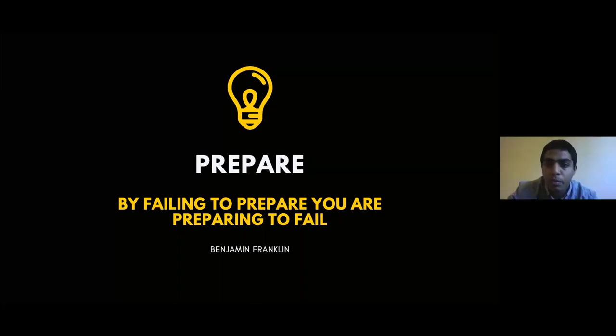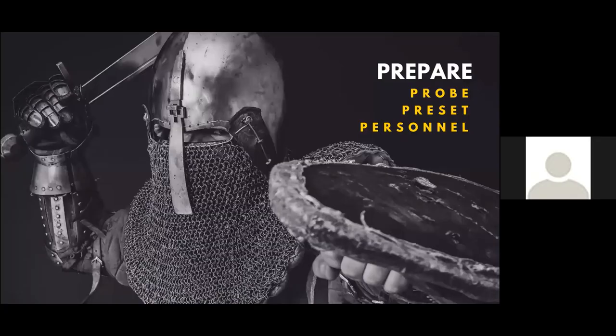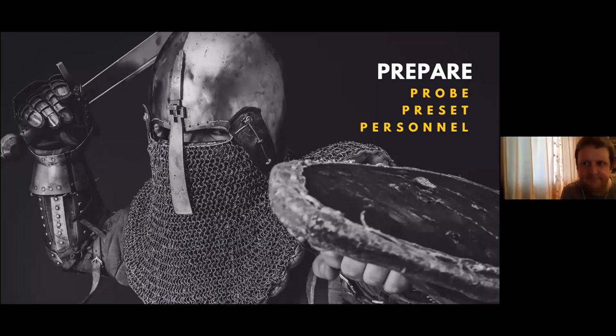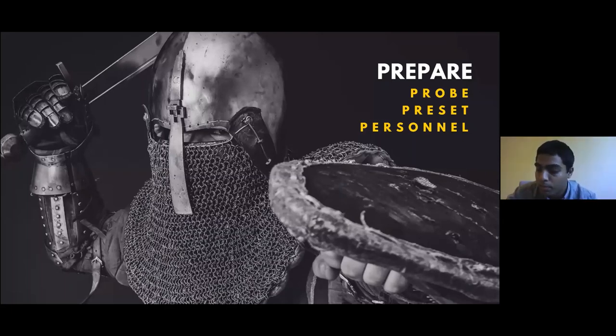The second important thing is to prepare before entering a patient encounter — have all equipment ready before you go in. I've put 'prepare' under three Ps: probe, preset, and personal. For the probe, you choose the correct probe, place jelly on it, and place a probe cover. Probe covers are stored below the machine. The curvilinear probe is most likely what we'll be using.